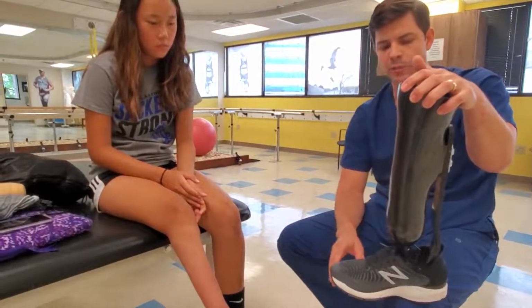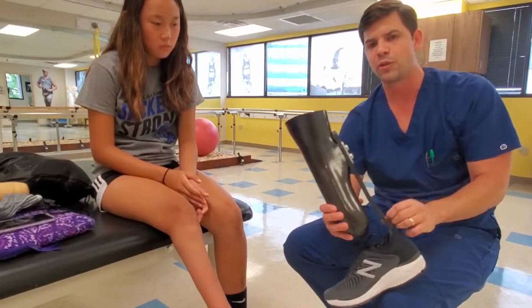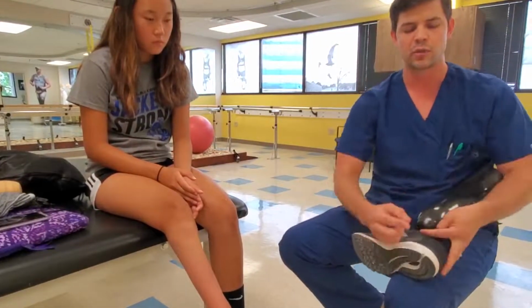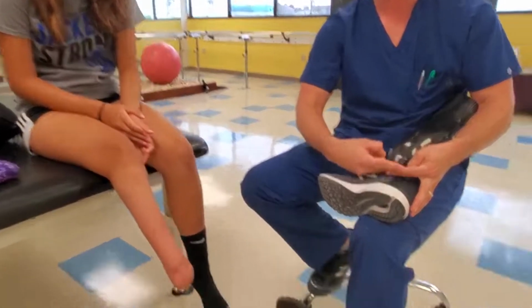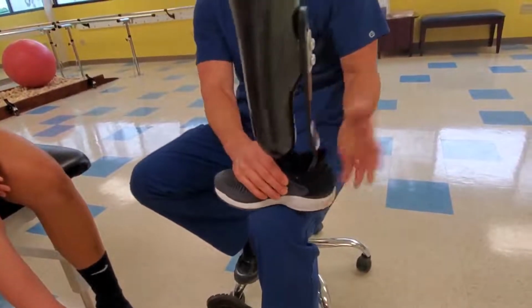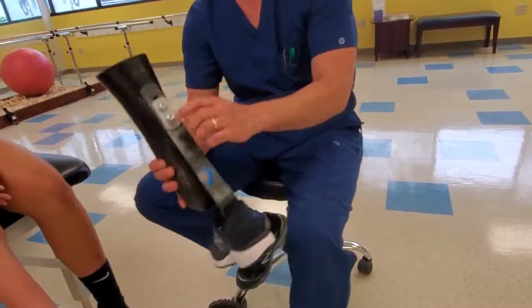And so after dialing in some alignment, the main thing we had to do to this foot was there's a heel bumper inside of the foot that restricts how much compression goes on from the heel plate to the pylon. That rubber bumper was blown out, and so we replaced it with a firm heel bumper. That's the only maintenance we had to do to this foot, but this foot has lasted, and because she grows, it still has this bracket.